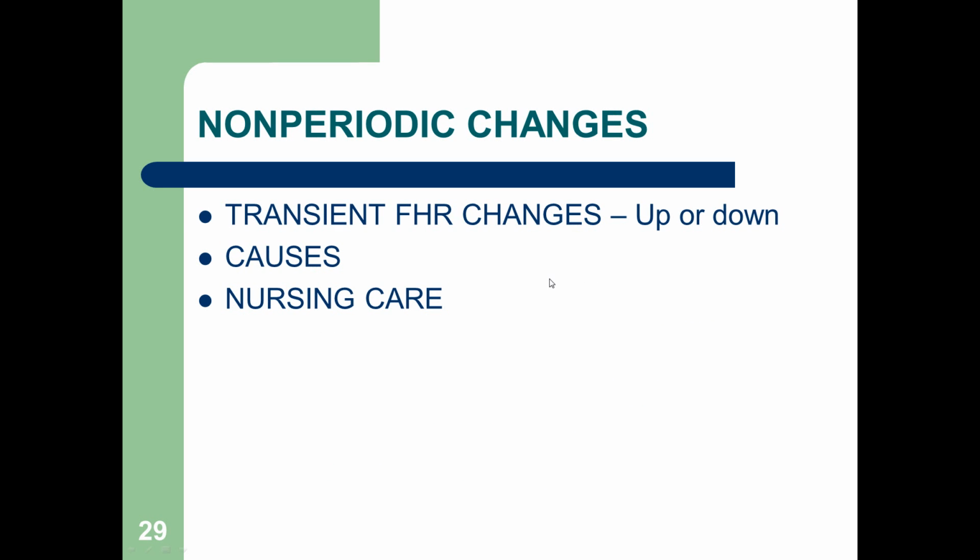Non-periodic changes is simply just that. Let me get to my notes. It refers to fetal movement or changes in position. It's not associated with contractions, okay? So nursing care, you're going to continue to monitor.